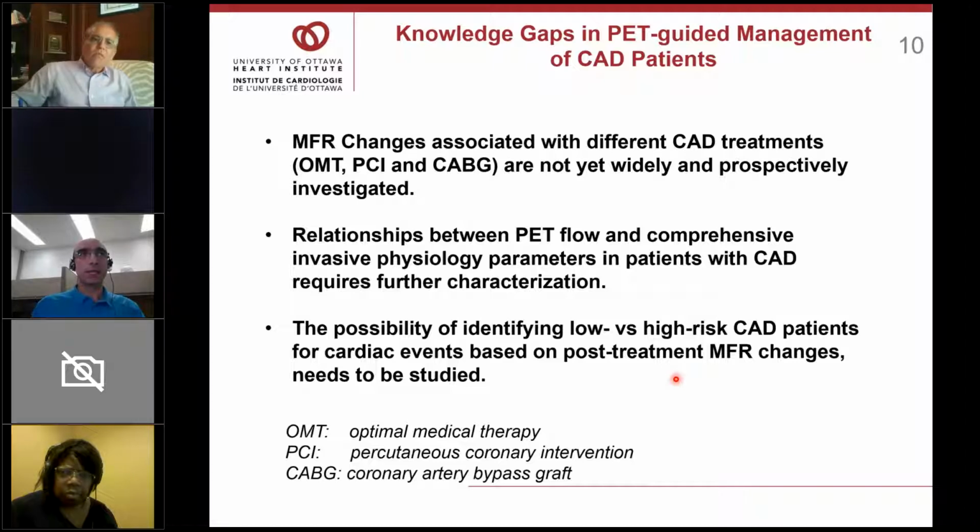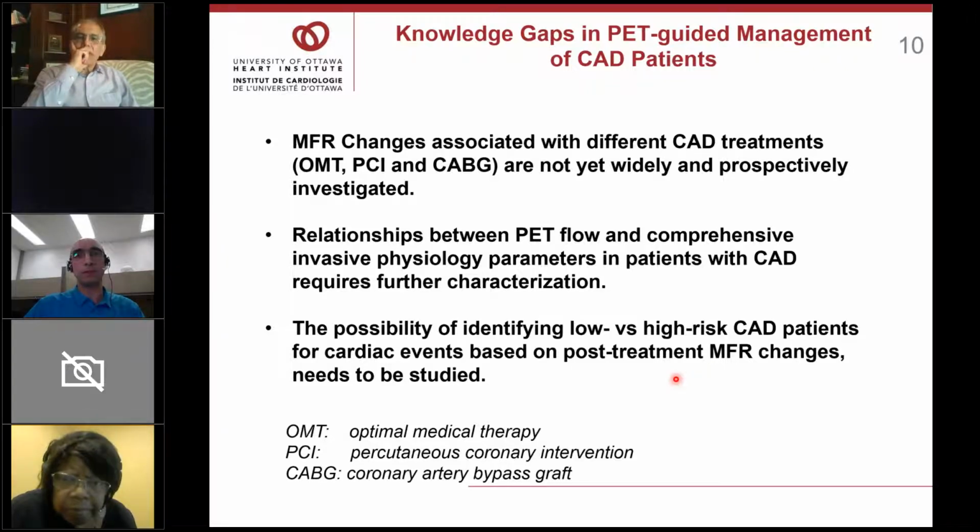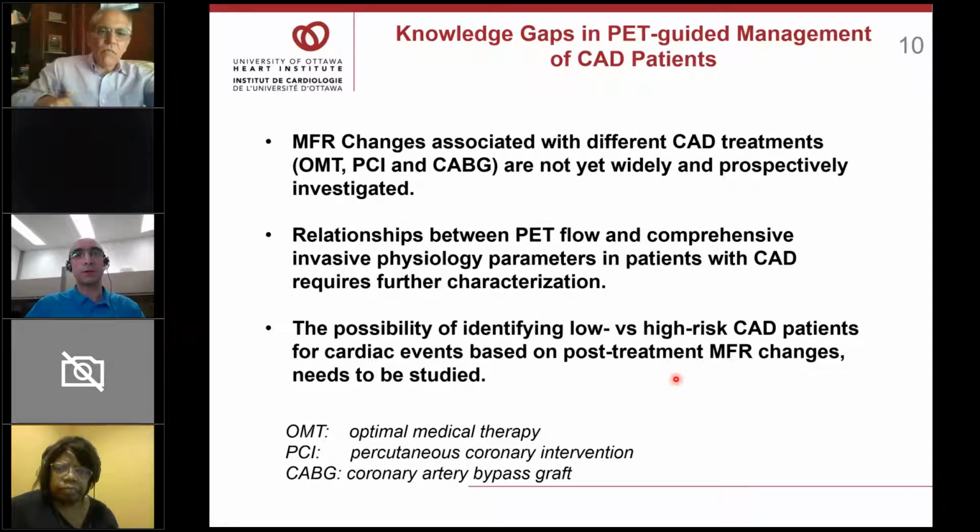However, there are still knowledge gaps in PET-guided management of CAD patients. MFR changes associated with different CAD treatments are not yet widely and prospectively investigated. Relationships between PET flow and comprehensive invasive physiology parameters in patients with CAD require further characterization, and the possibility of identifying low versus high risk CAD patients for cardiac events based on post-treatment MFR changes needs to be studied.